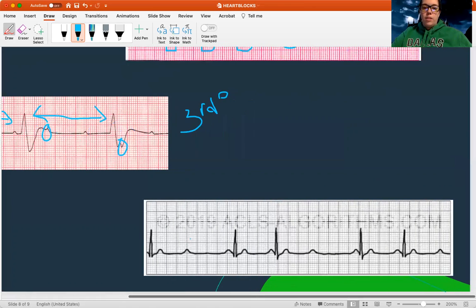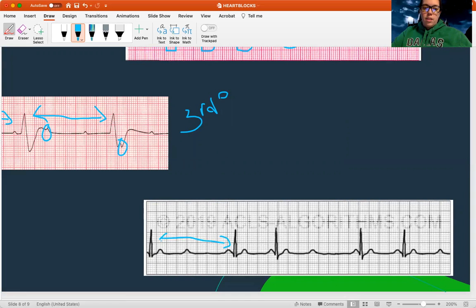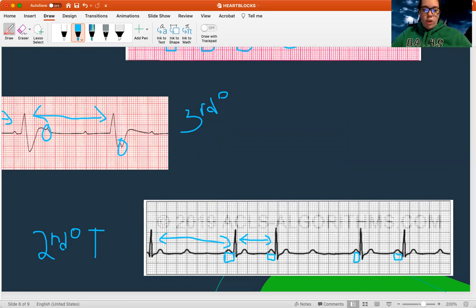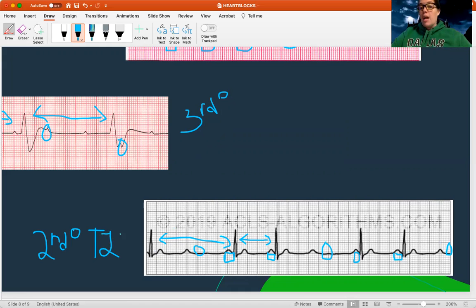Last but not least, let's look at this one. There are obviously some irregularities — a very big difference between these distances. Because of that, I know this has to be a second degree. Now I'm looking at the PR interval: normal, normal, normal — they're all staying the same. But look — there are a bunch of random dropped beats. A missing beat here, a missing beat here, a missing beat here. This is second degree type two — not getting longer and longer and dropping, just randomly dropping beats. I cannot predict them.